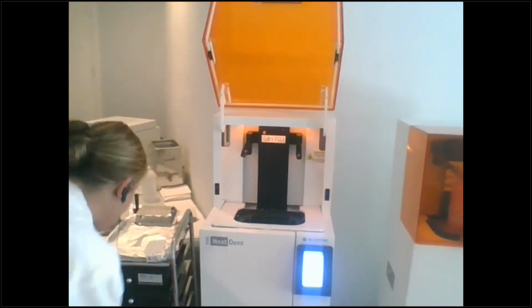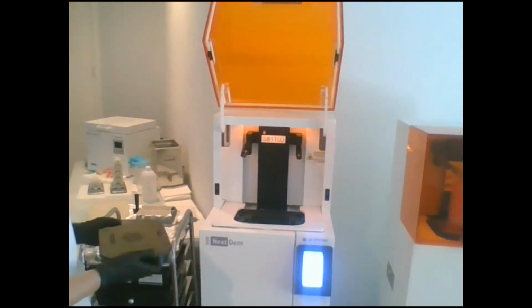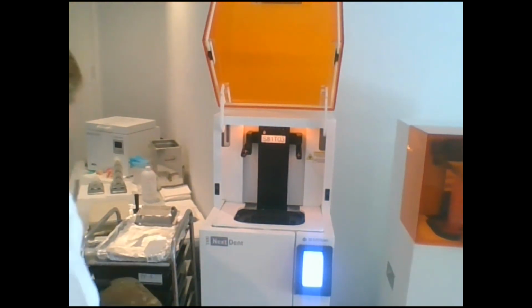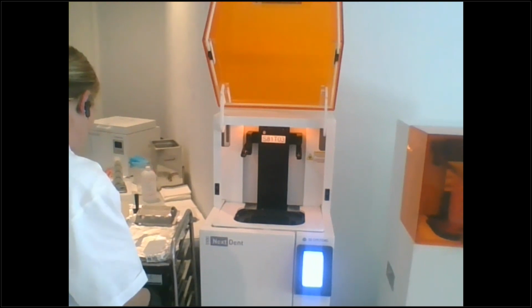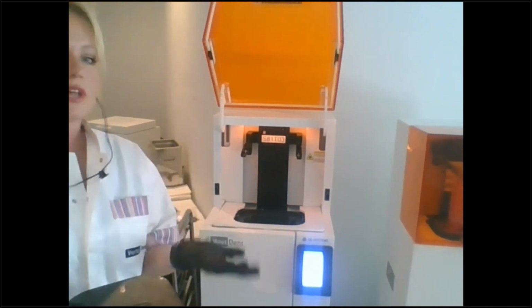So what I'm going to do is get my model material out, and I'm going to put it into, oh, this is not the right material. That's why you label your drawers. Okay. Now I'm going to put it into my printer. And this is how easy it is to change out material. There's nothing else you have to do.